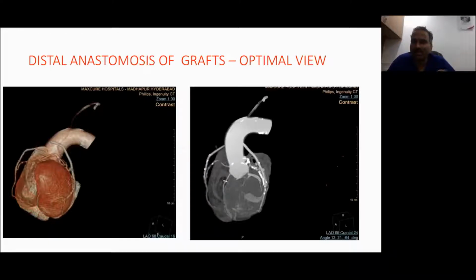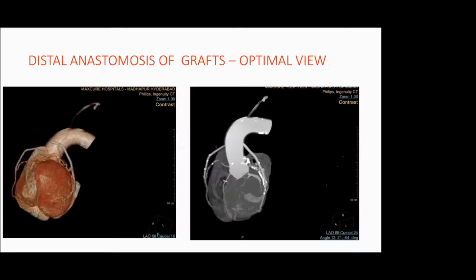So, someone raised a hand, Harikiran. Sir, you raised your hand. Sir, sorry to interrupt you, sir. In the CT angiogram, is the anastomosis in the middle of the artery? Is it anastomosing with the native artery, or is it at the junction of the myocardium to the vessel, sir? Because here it seems there is some gap between the anastomotic site and the myocardium.